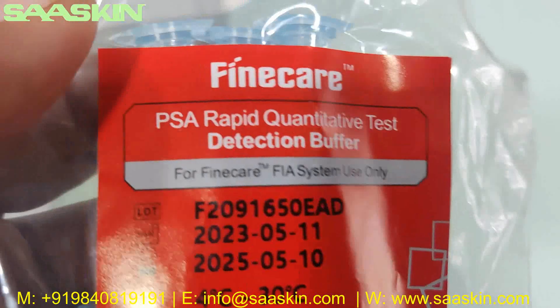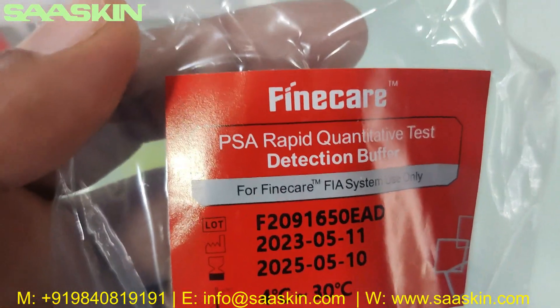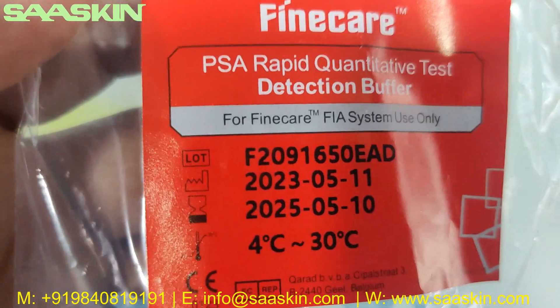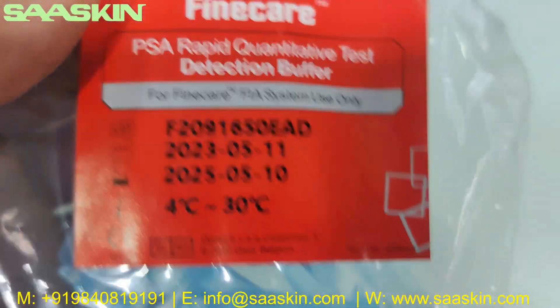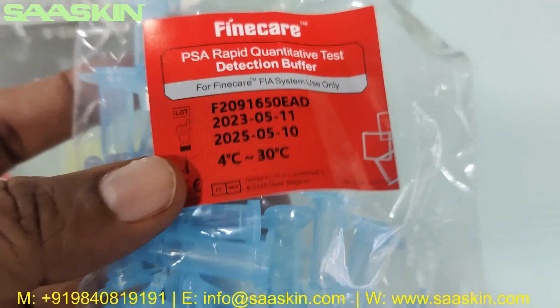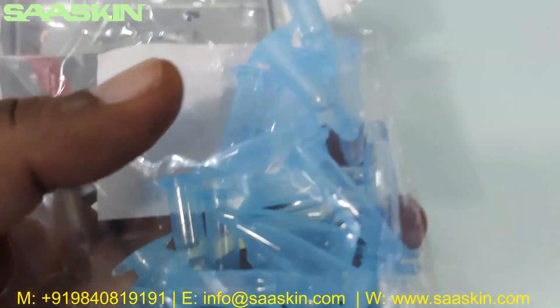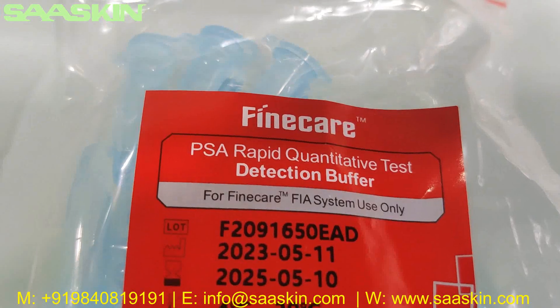There is the FineCare PSA rapid quantitative test pouch. You can see the lot number and also the manufacturing date and expiry date, along with normal room temperature storage instructions. You can also see there is a dilution buffer — FineCare rapid quantitative dilution buffer — and you get 25 individual buffers, neatly packed.